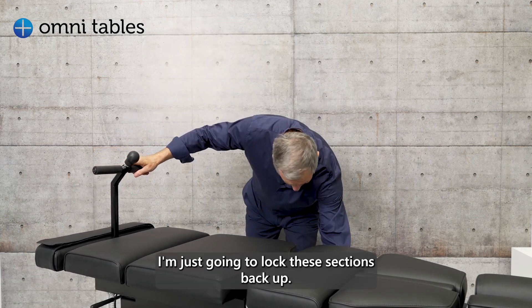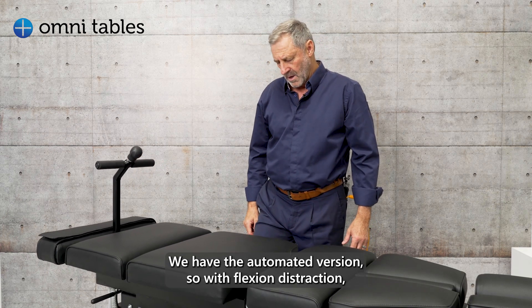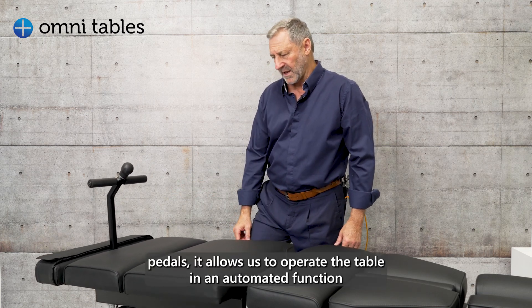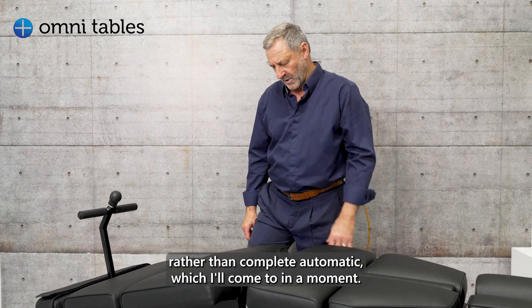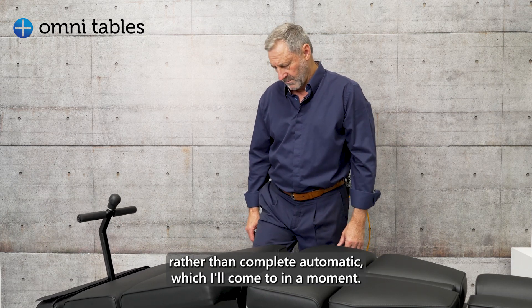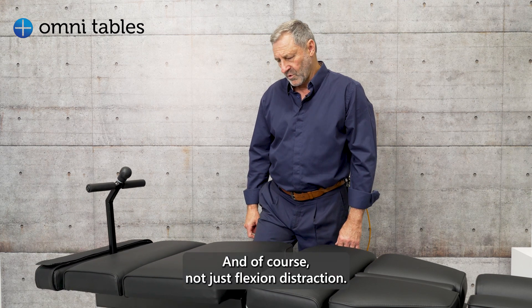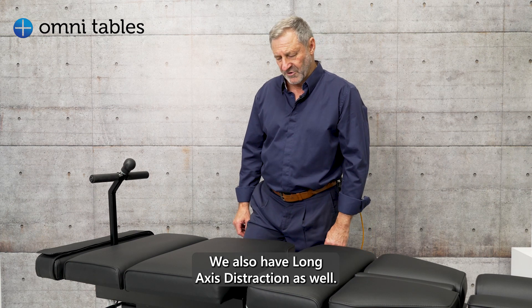I'm just going to lock these sections back out. We have the automated version — with flexion distraction we can go negative, and with the foot pedals it allows us to operate the table in an automated function, rather than the complete automatic mode which I'll come to in a moment. And of course, not just flexion distraction — we also have long axis distraction as well.